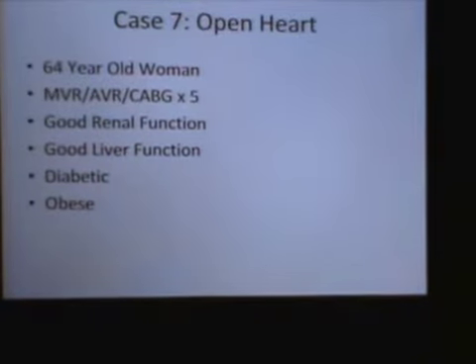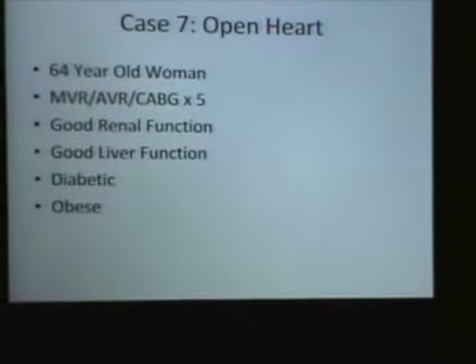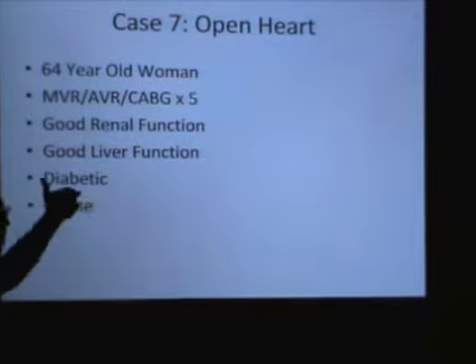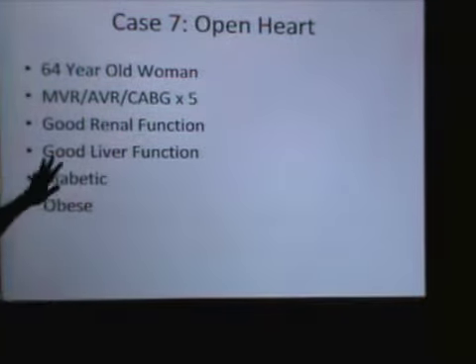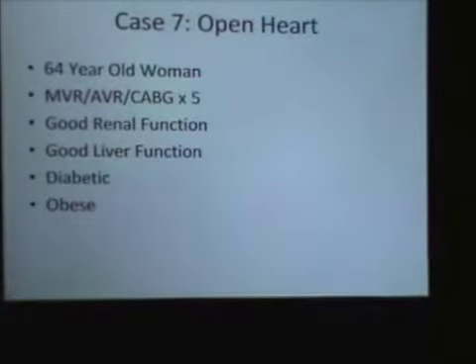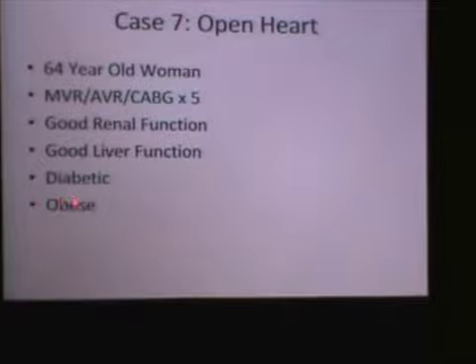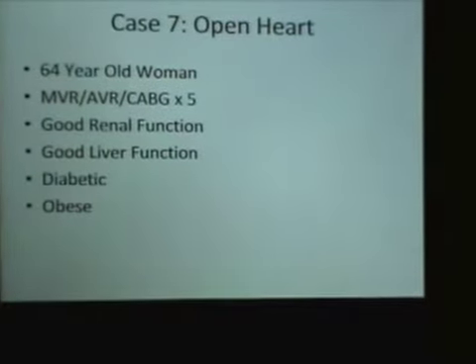So with what you know now, would you expect this patient to be hypercoagulable, normal, or hypocoagulable? It's based on what you see here. Hyper, you're all correct. Here's your clues, diabetic and obesity.